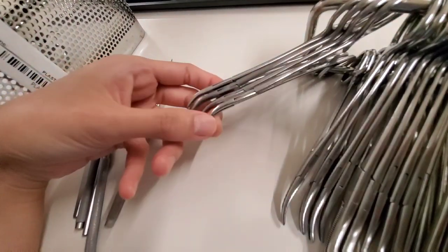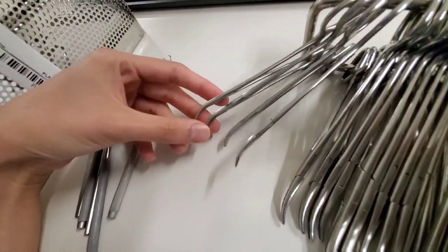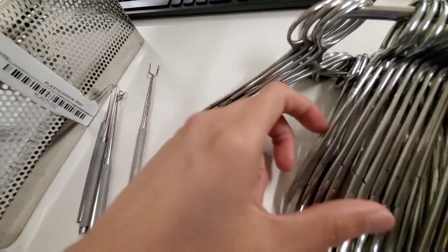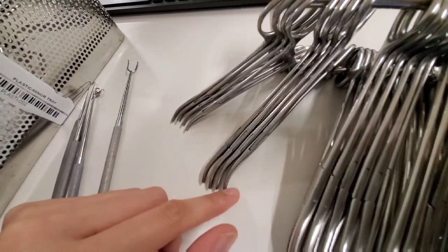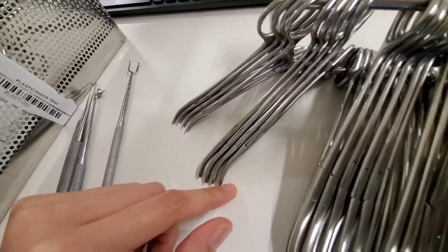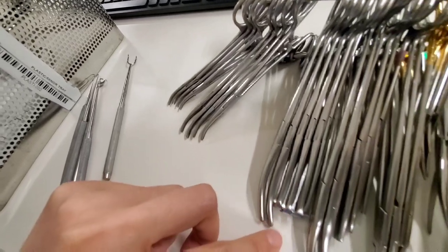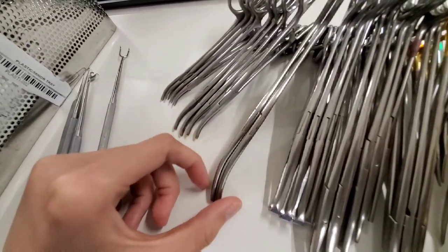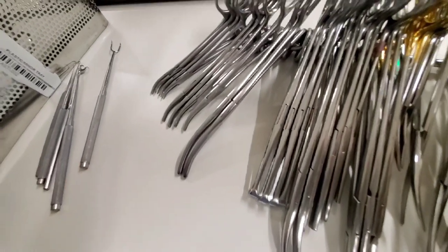These Criles are for bleeders. Hemostats can also be used for bleeders, but mostly they're used for suture retention.